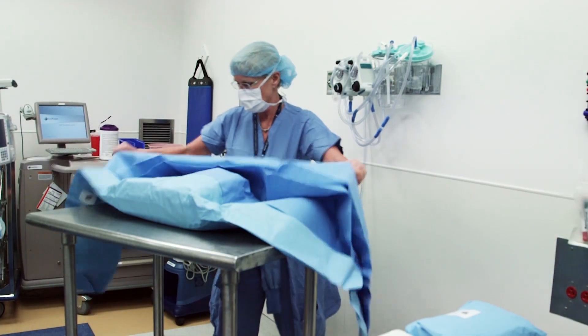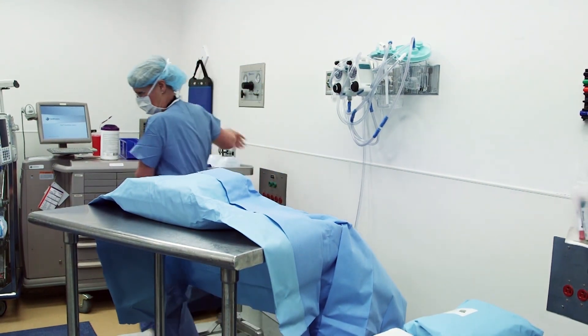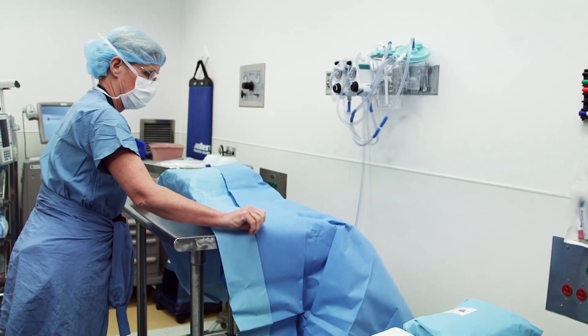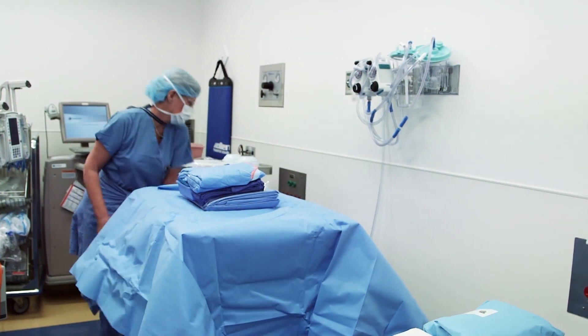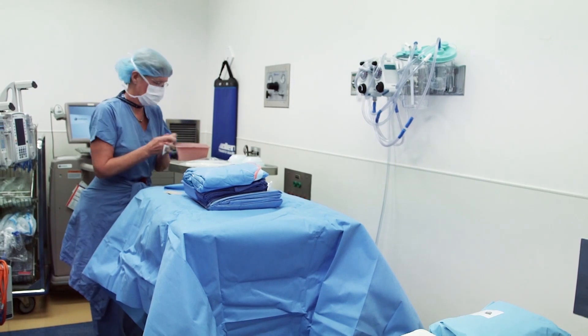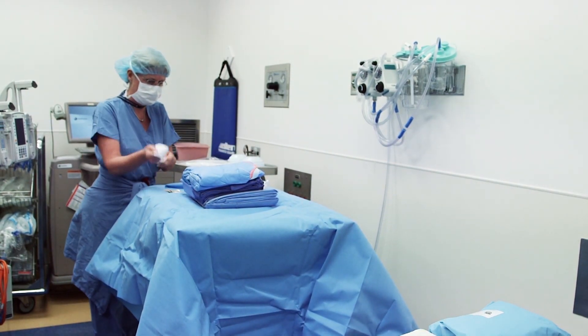Sterile Field. Prior to scrubbing, a sterile field must be created so drapes, gowns, gloves, and instruments can be opened in a sterile fashion. As seen here, the nurse, who is not sterile, is opening up a pack and pulling away the edges of the drape to create a sterile field. Items are opened in a sterile manner and dropped onto the field, being careful not to contaminate the sterile field.